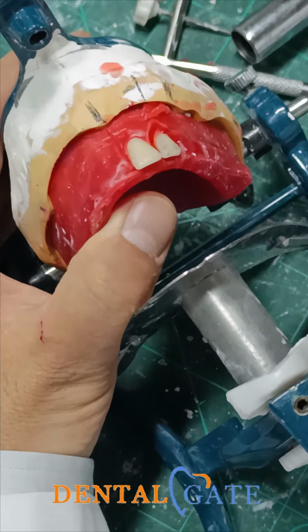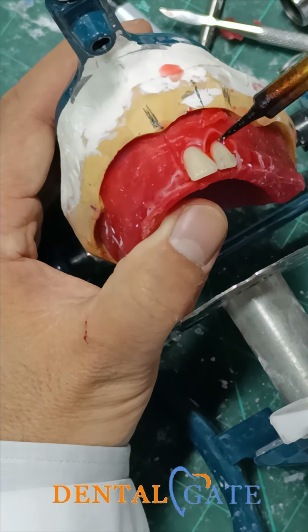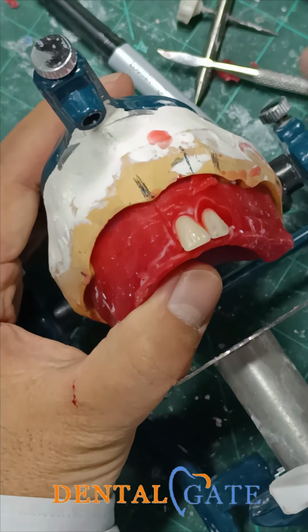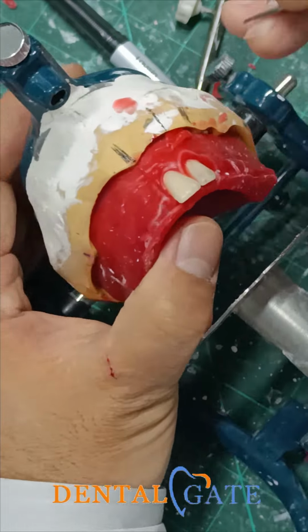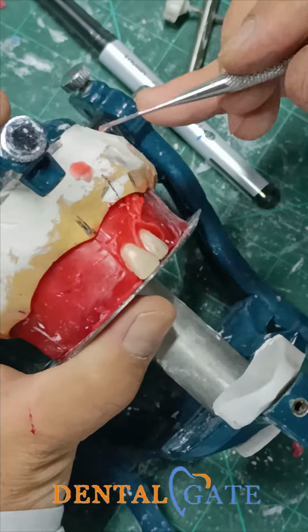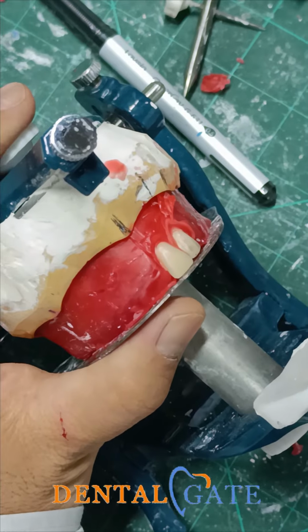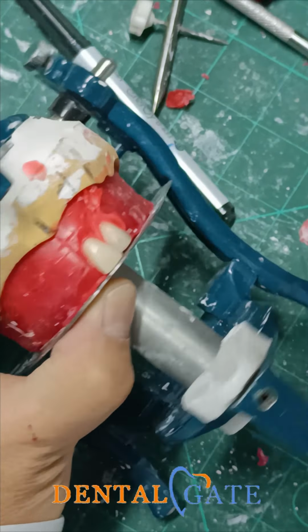Why? To make a double check, to evaluate the long axis. Don't put any wax upon the teeth. Just remove the wax to evaluate the long axis of the tooth. After that, I will make a carving according to the interpapillary space and other features.